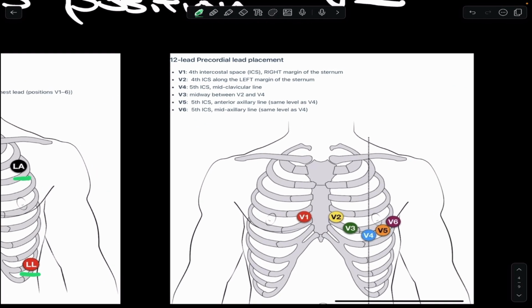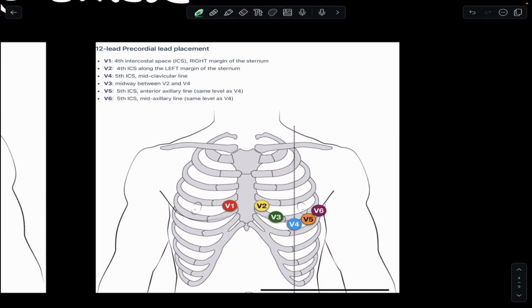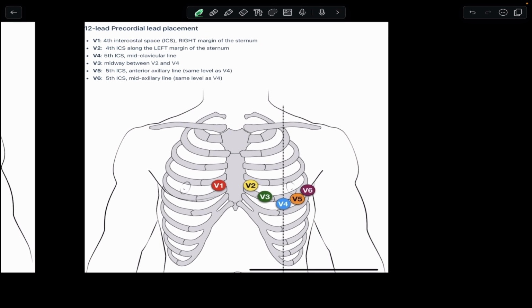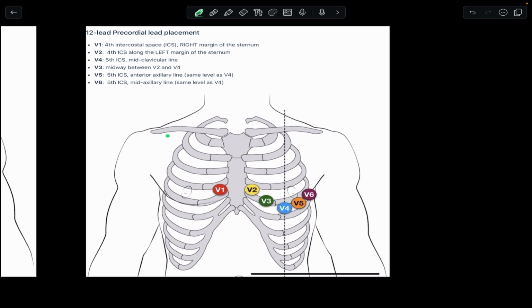And then the most advanced ECG, you'll see this plenty in anesthesia, but certainly in the emergency department, or if you have any concerns of ischemia, if you're ordering an ECG to get a high quality reading. But this is going to be the 12-lead system. So again, this typically has your 4 limb leads in the 4 quadrants.